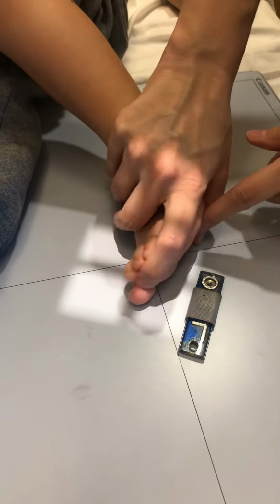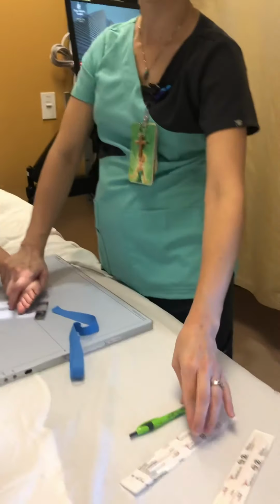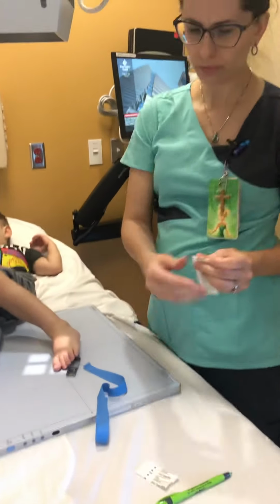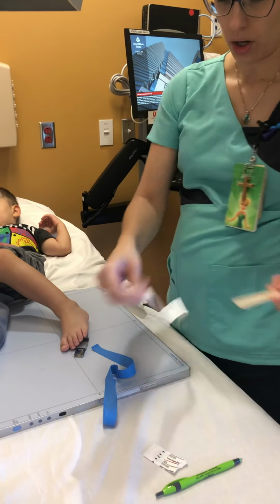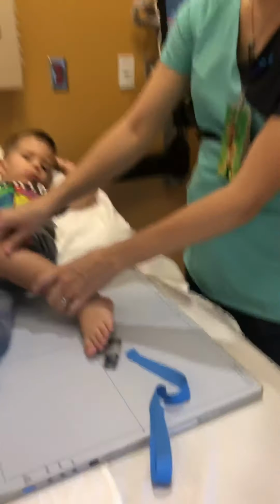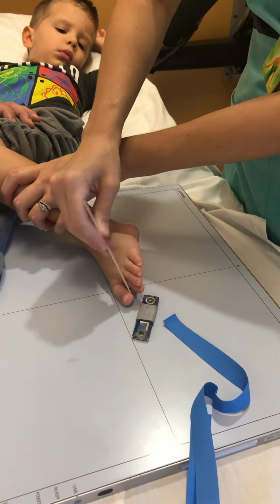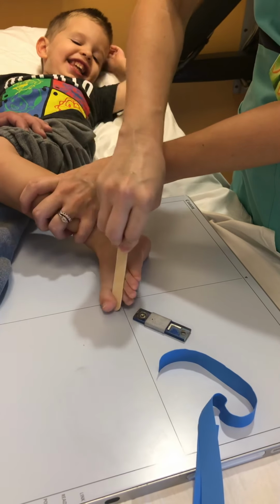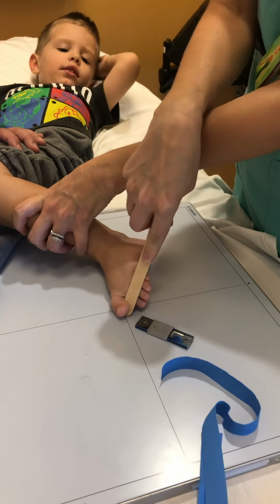Now, how do we do that? Well, you can do a couple things. I like to use tourniquets. You can also use tongue blades that are really nice. That doesn't cause a lot of artifact or anything. We can turn them to the inside, and again, you can do something like that. Oh, what? Your little toes. Something like so to try and isolate the toe itself.